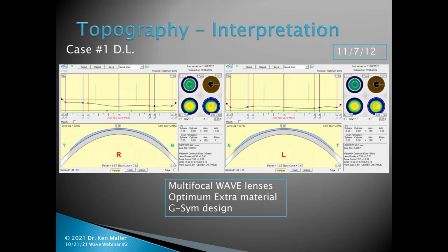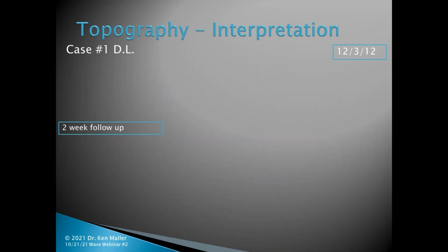These are the pair of multifocal wave lenses I designed. I put them into Optimum Extra Material. I did a GSIM design. It's a multifocal. I'm not going to get into the nitty-gritty of this design because that's not really the focus of this particular webinar. And we had her back for her 2-week follow-up.